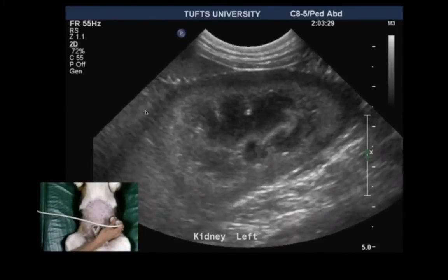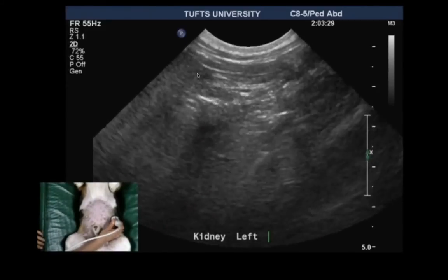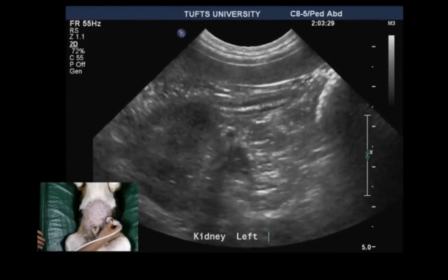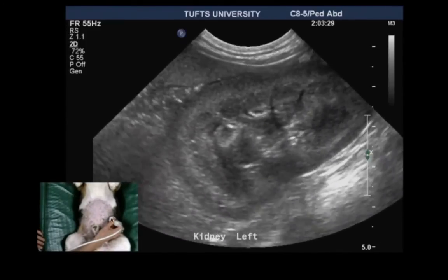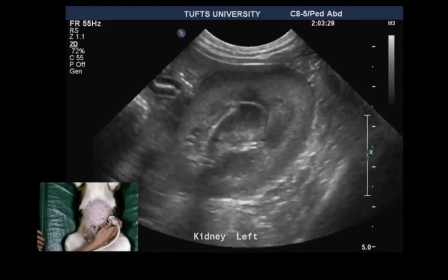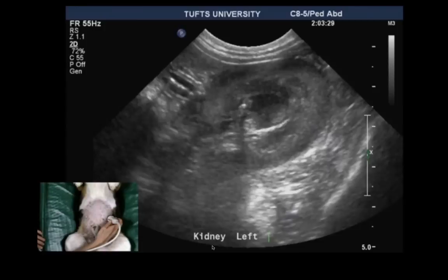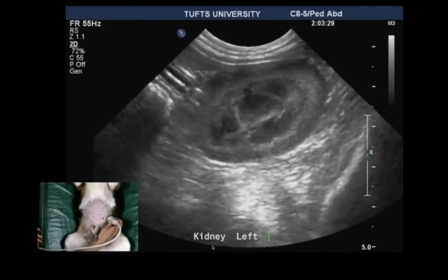The spleen is located in the near field, and the probe is gently displaced from lateral to medial and medial to lateral to cover the entire width of the kidney. The probe is then rotated 90 degrees to obtain a transverse image through the kidney. Several segments of intestines and colon are seen in the near field as we move the probe.